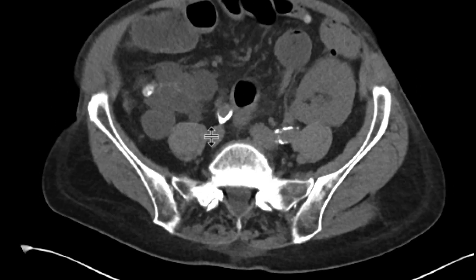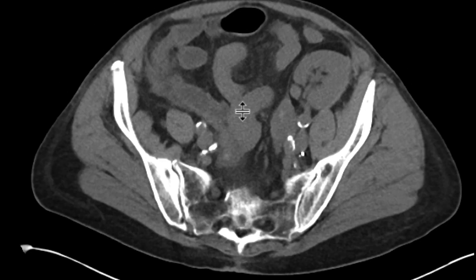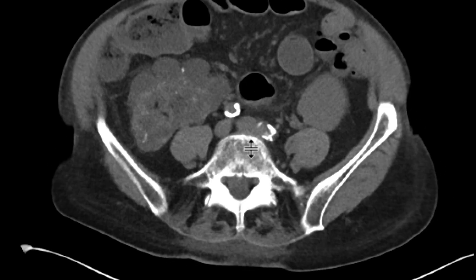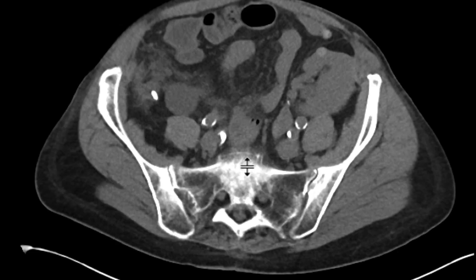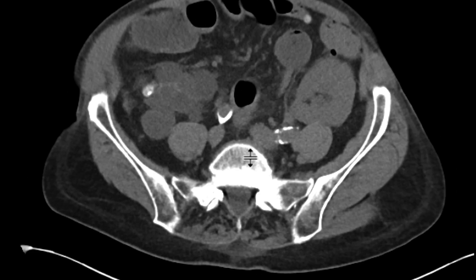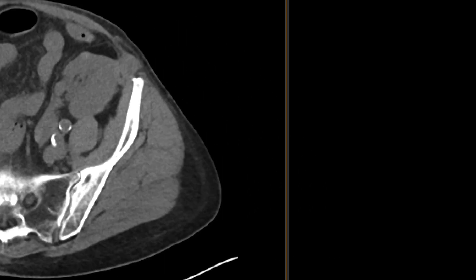Let's examine this a little bit closer. It almost looks like it's coming from the cecum, going upwards. We can see it right over there. That's a blind-ending tubular structure. It's thick-walled. There's inflammatory change with right lower quadrant pain. You have to be worried about acute appendicitis because there's probably an appendicolith as well associated with this over here.